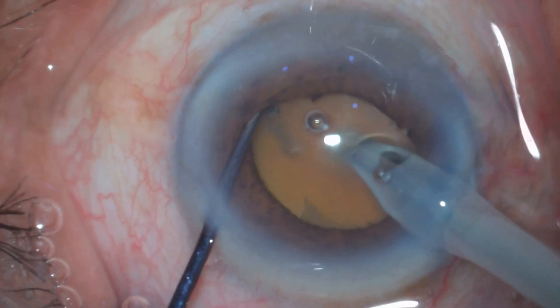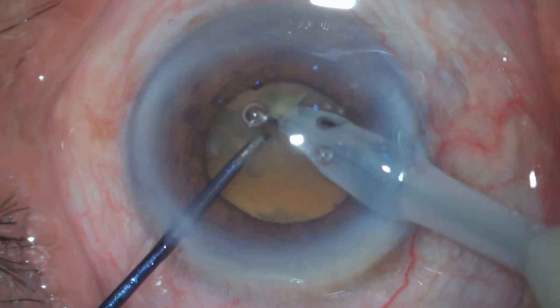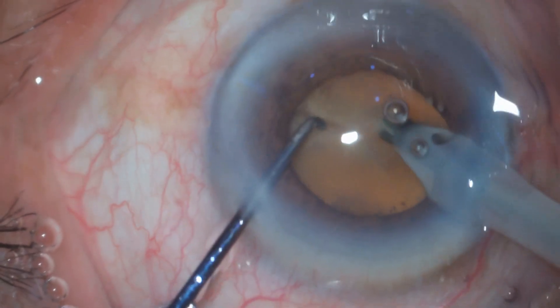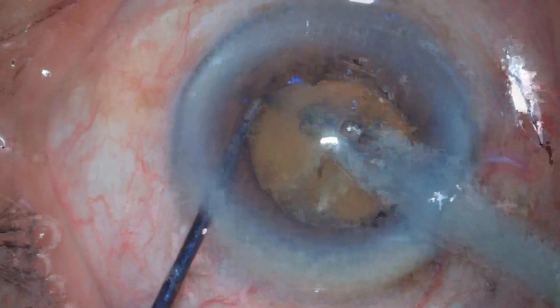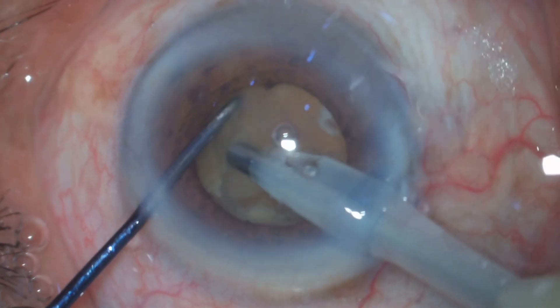This nucleus is quite slippery and it is a hard nucleus as well, so one has to be very careful before engaging the nucleus into the phaco probe. I have just engaged it and started an initial crack, but I have not gone for a full crack or full separation of the nucleus fragment.